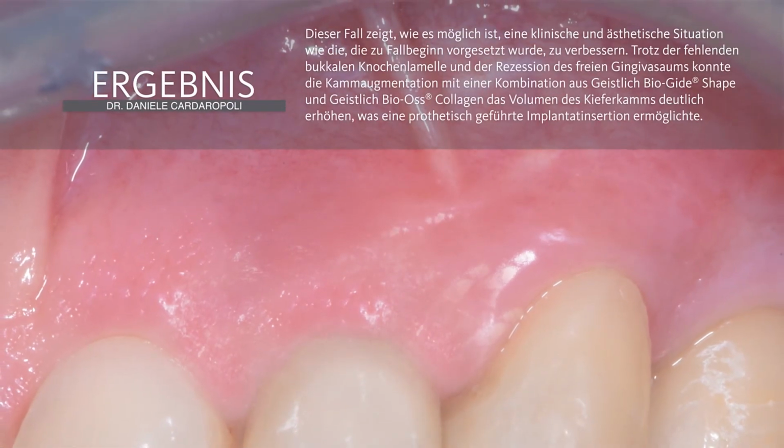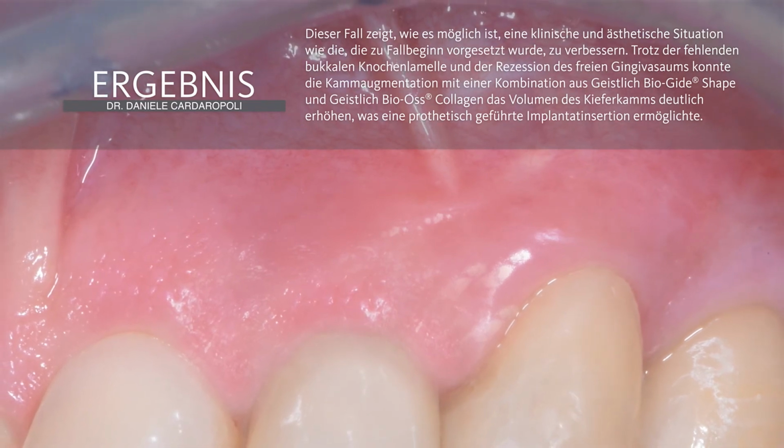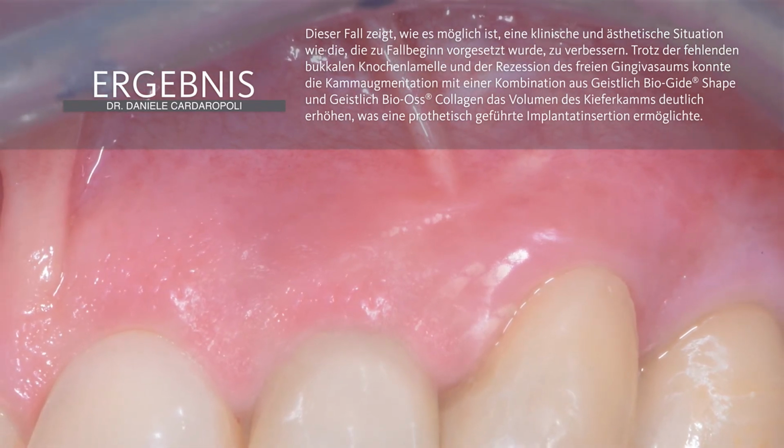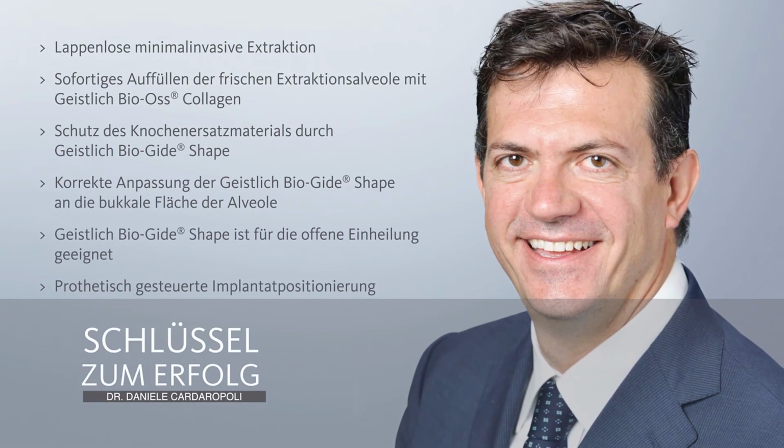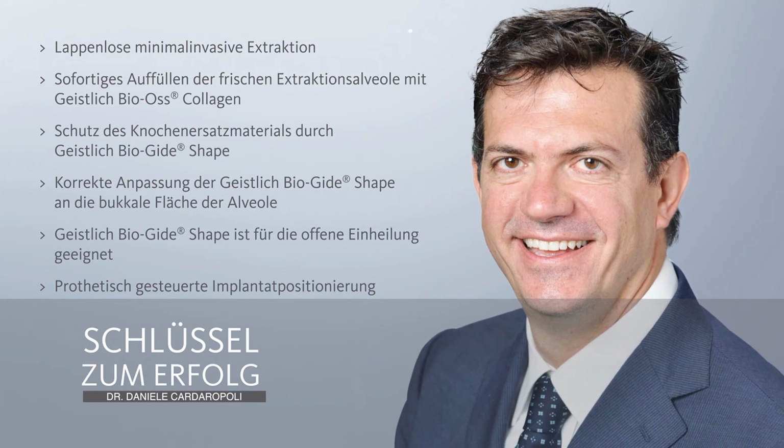Despite missing the buccal bone plate and the recession of the free gingival margin, this ridge augmentation procedure has been able to provide an adequate quantity and quality of bone for implant placement 4 months after the ridge preservation procedure. We have to point out that with this kind of surgical approach, we can achieve predictable outcomes in order to maintain long-term stability, both from the aesthetic and functional point of view.